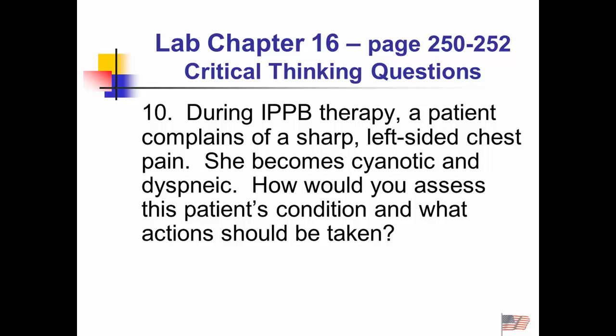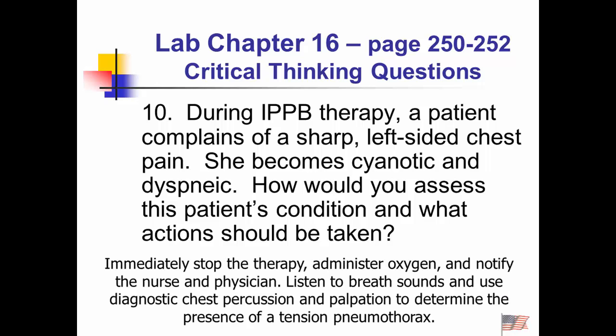During IPPB therapy, a patient complains of sharp left-sided chest pain. Hey, that sounds like a case study. Cyanotic and dyspneic, what are we going to assess? Well, first of all, I'm going to stop the therapy because this patient is not doing well. I'm going to administer oxygen and notify the nurse and physician. And listen for breath sounds. What would you anticipate breath sounds sounding like if I had a pneumothorax?